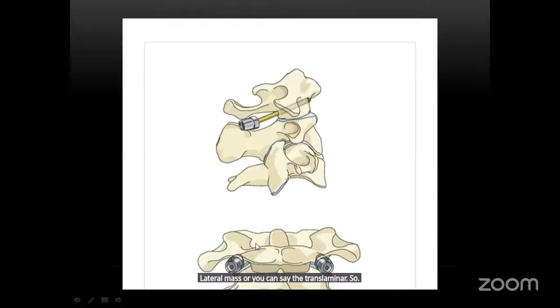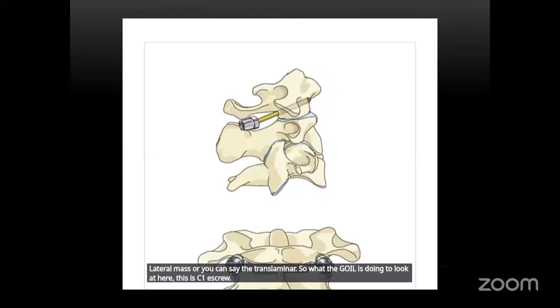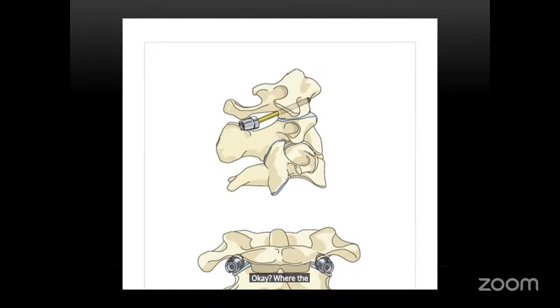So what Goel is doing, look at here, this is the C1 screw. Where the C1 screw is placed, just below the arch of the C1.